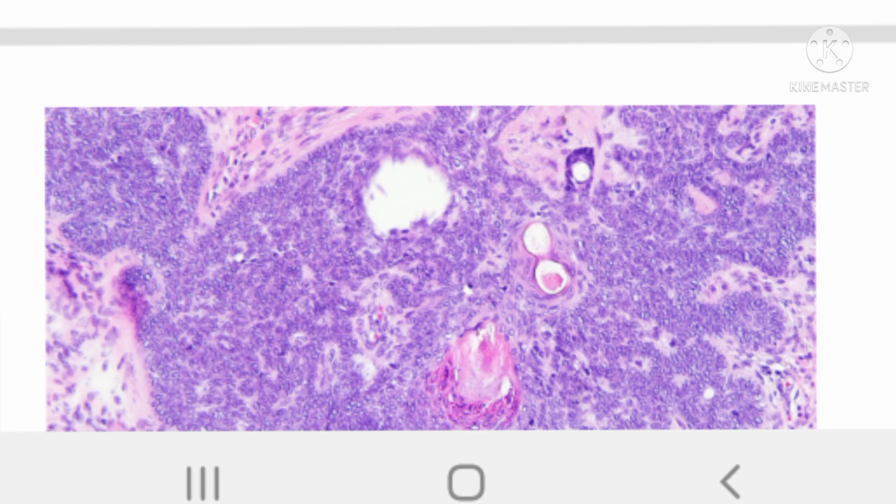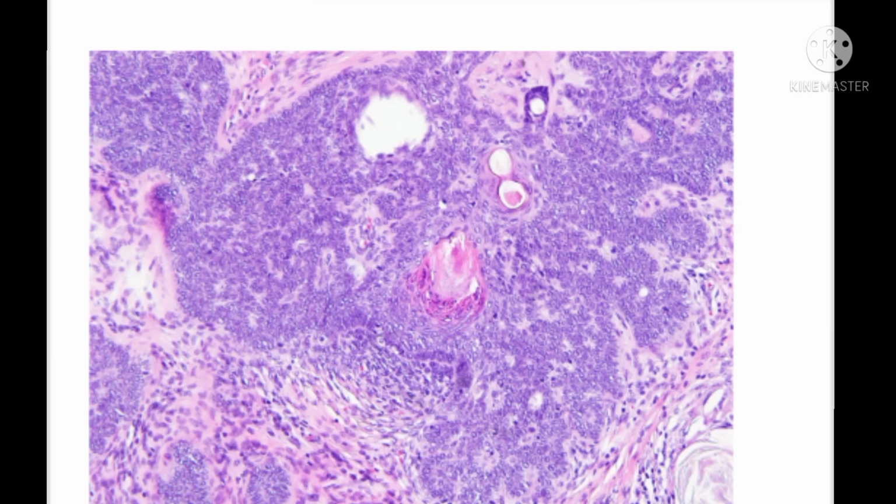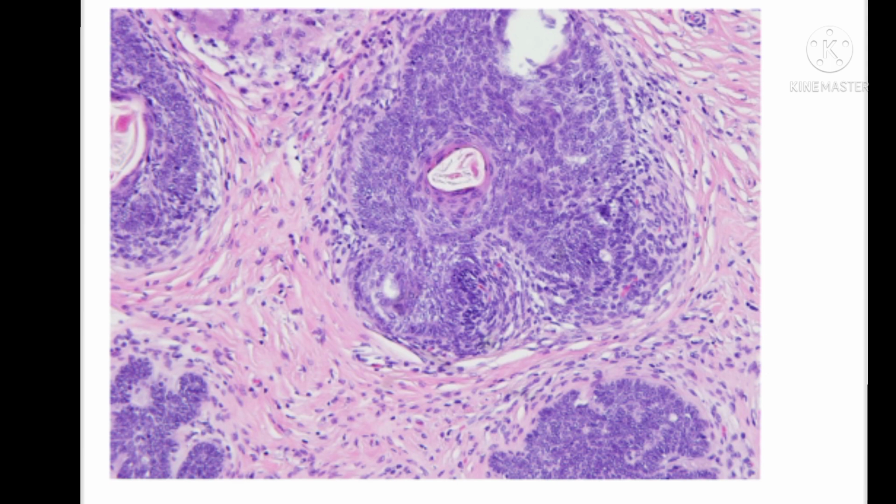And this section shows an island of basaloid cells with a palisading pattern around. And here there's a cribriform pattern in the corner. This section shows fibrocellular stroma around, and there is a round to ovoid stromal cell pushing over here, and this is known as a papillary mesenchymal body. And all these features are of trichoblastoma.